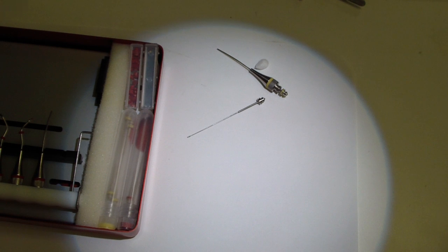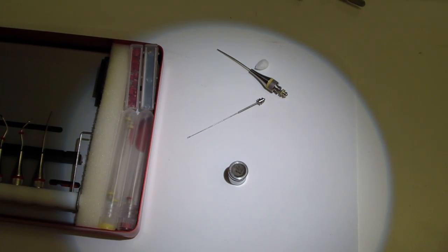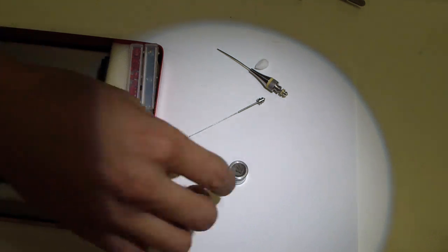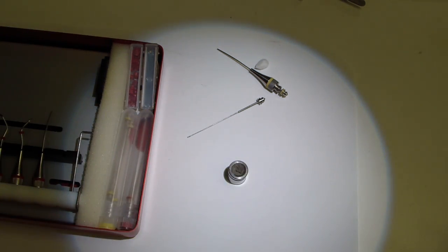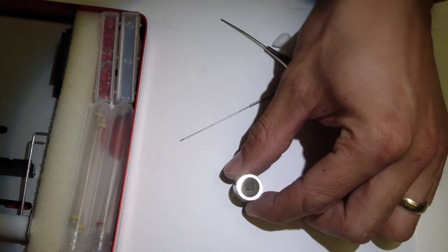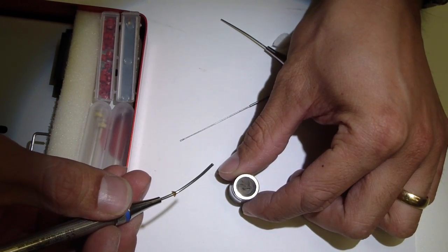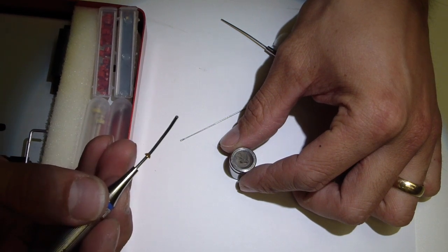Now what we're going to do is load this and see it. I've got some MTA placed here and I'll show how to mix that in a second. This is the little dappin dish. It's typically how you want to mix your MTA. I mean, you can mix it any way you want. I'm going to use the large carrier for example.